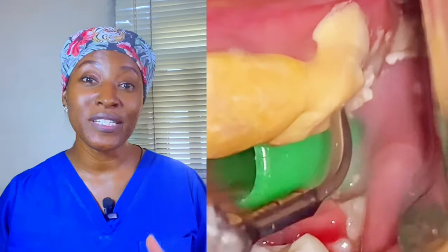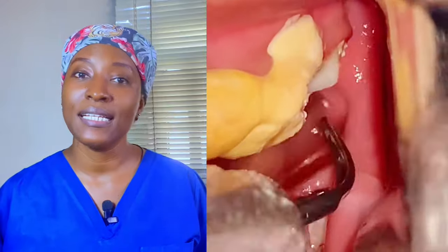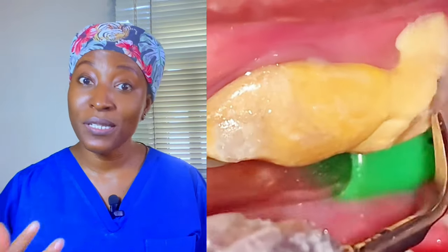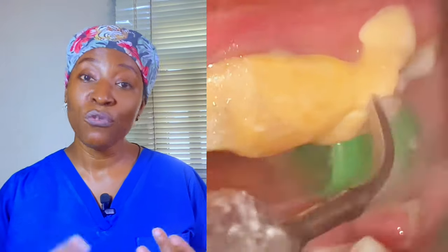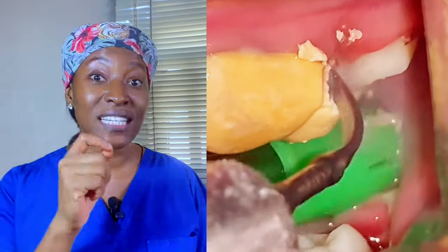This is what it can look like if it's been a long time since you visited the dentist. When we talk about regular dental checkups and cleaning, we are talking about a way to prevent gum disease by removing accumulated calculus and tartar from the gum line. This patient has not gone to the dentist in a long time.